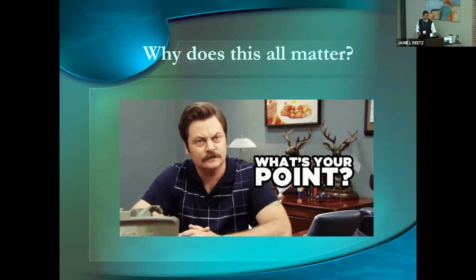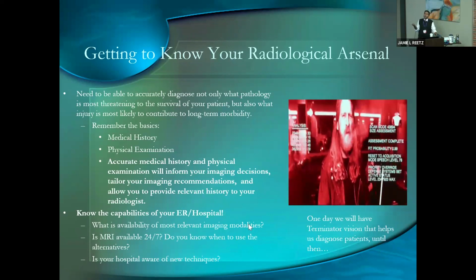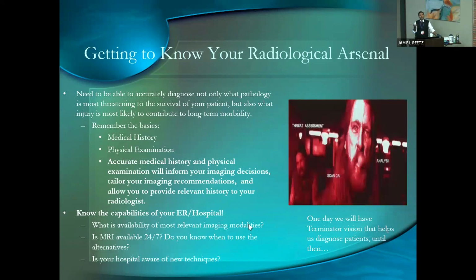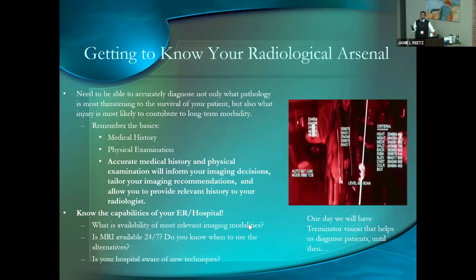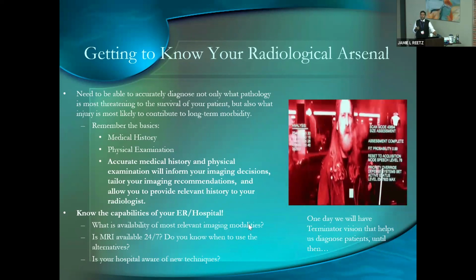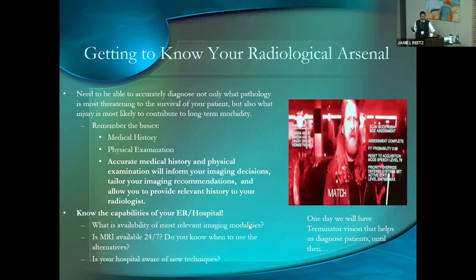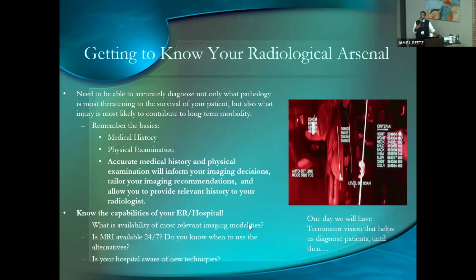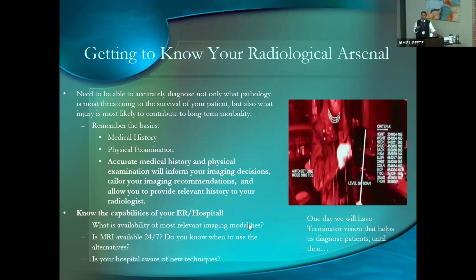Now, again, I hope I don't bleed over too much, but I'm going to start going even faster. The idea here is I want you to know your radiological arsenal. For me, I think of radiology as another tool in your bag of tricks on how to get your patient their diagnosis. Obviously, history and physical exam, despite what the modern world will tell you, still play a huge part in your patient's workup. Medical imaging will help, and the better information you give us, the better we can tailor those examinations.